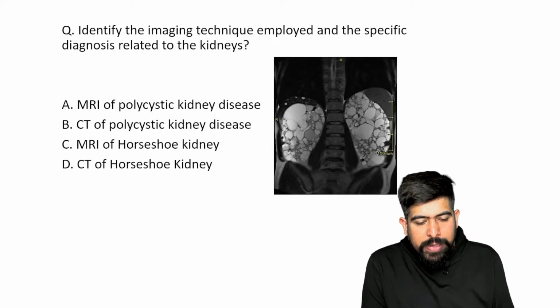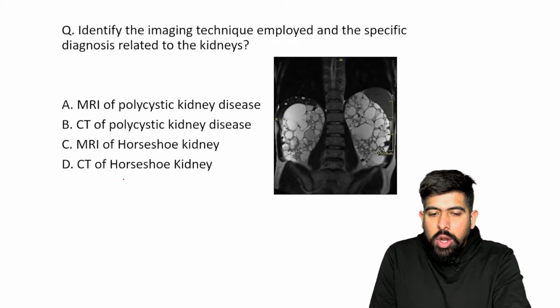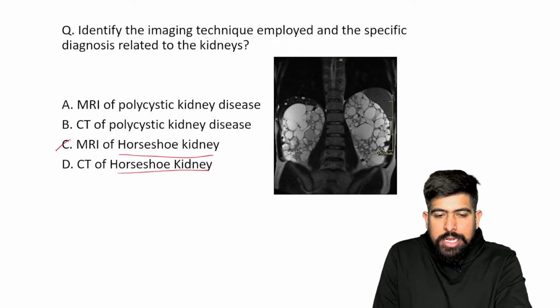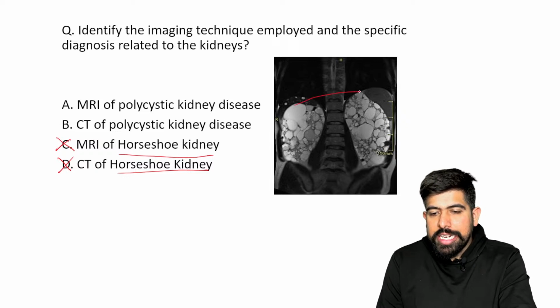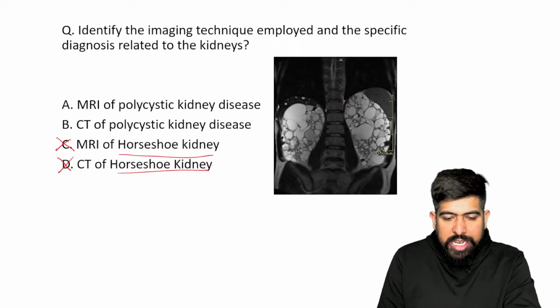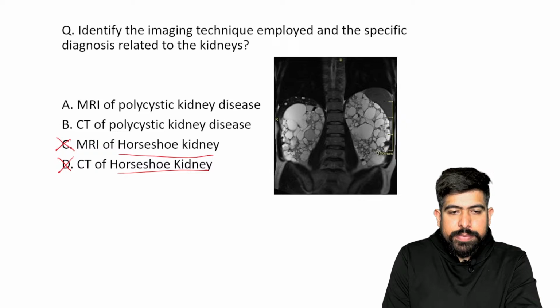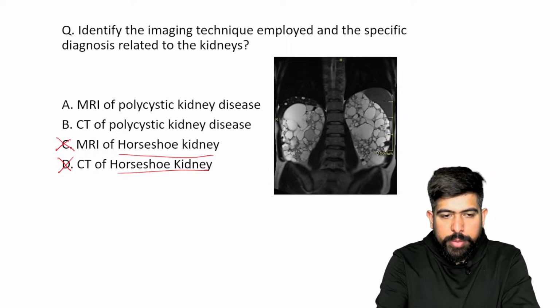First of all, I'm clearing this up: this is not the horseshoe kidney. It is not possible that this is the horseshoe kidney, because we already know that in horseshoe kidney both kidneys are attached together. Yes or no? So this is not horseshoe kidney. Just wait, I'm going to show you the image of horseshoe kidney. Just a minute, I'm entering one more image.